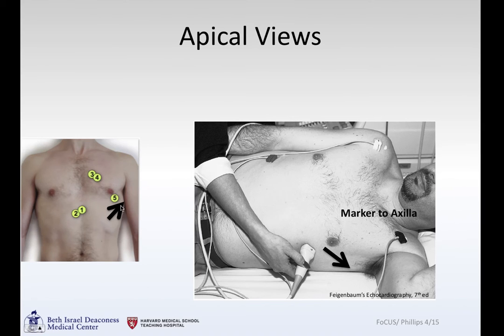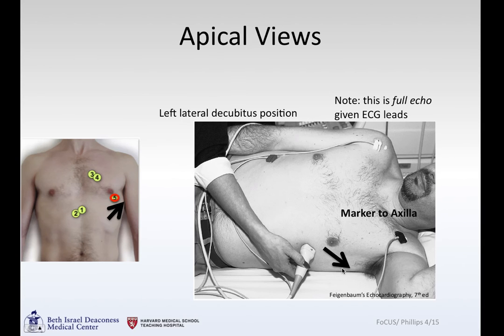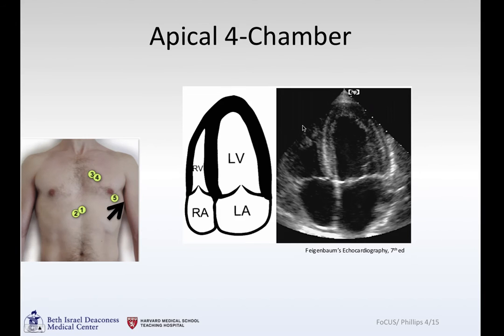For apical views, we've moved from up here down to the apex of the heart, with the marker off to the axilla rather than pointing off toward the shoulder. Note this is a full echo given the ECG leads present, and the patient is comfortably in the left lateral decubitus position. In the apical four-chamber view, you open up the left ventricle, left atrium, right ventricle, and right atrium. This is the inferior septum and anterior lateral wall.